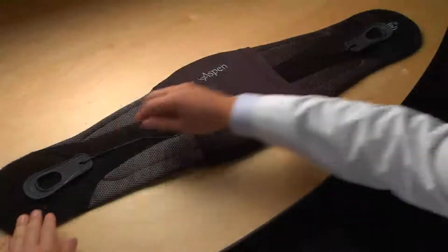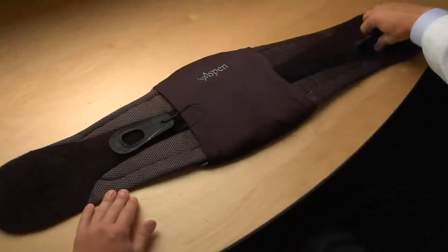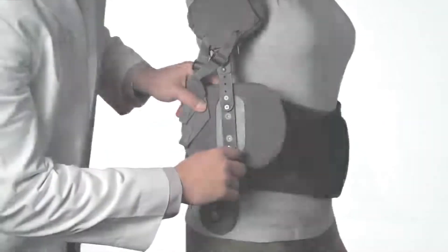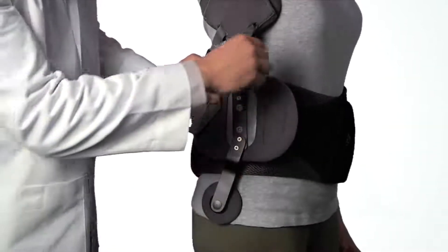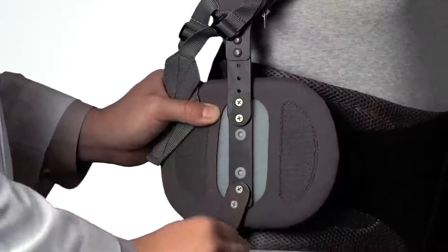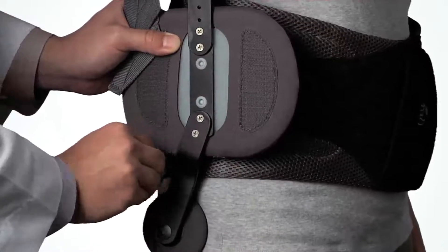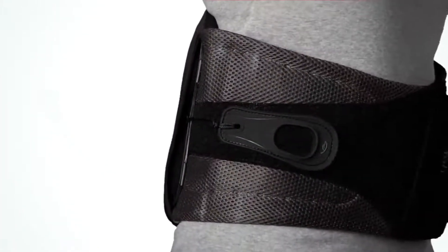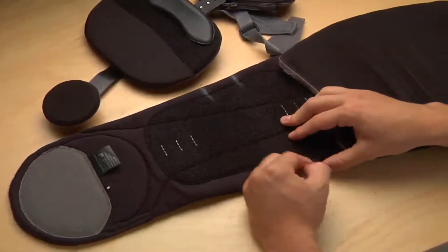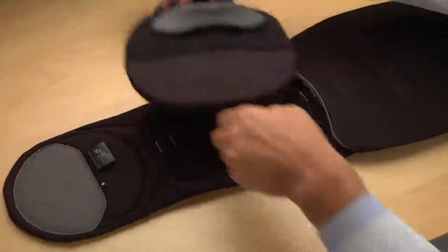Before the belt is applied, ensure that the pull tabs are positioned close to the center of the back panel so that the brace can be fully extended. With the belt applied, place the strut assembly over the belt in the proper position. With chalk, create four marks as shown, then transfer the marks to the inside of the belt and use them to position the strut assembly. Press down to secure.